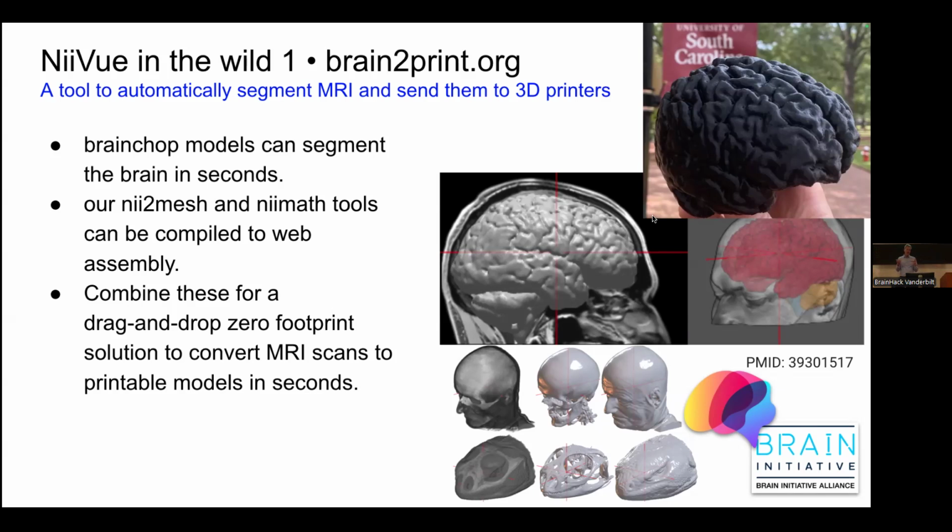And one of the interesting things is we all realize how AI models can revolutionize things. But we as scientists have a challenge that when we have a model that works, we want other people to use it. But there tends to be this really complicated chain. What type of hardware do we need to process it? What is all the software stack to do that?